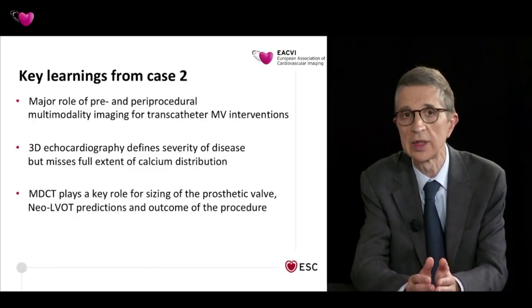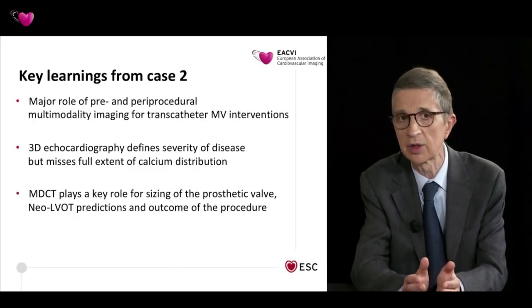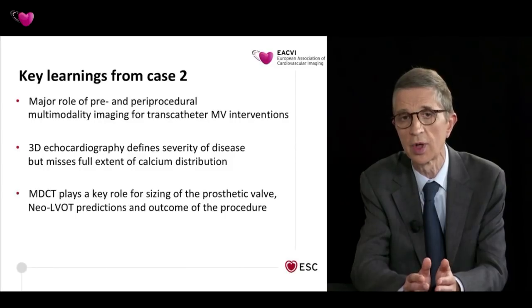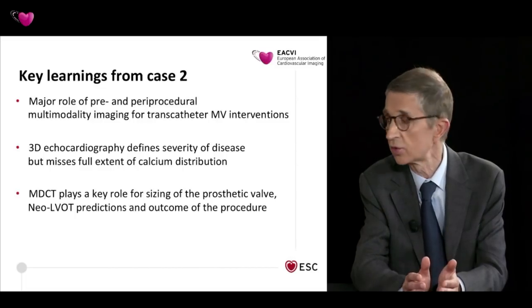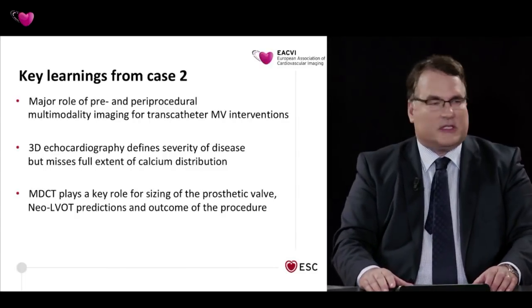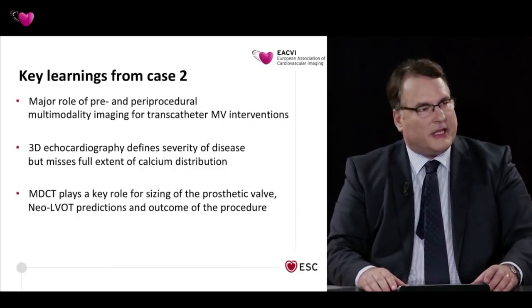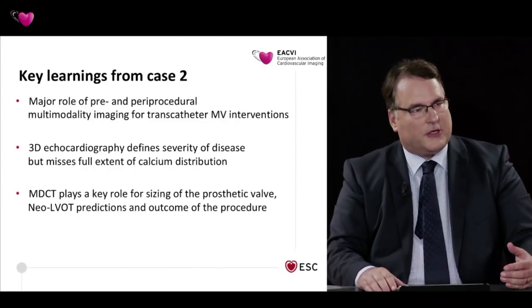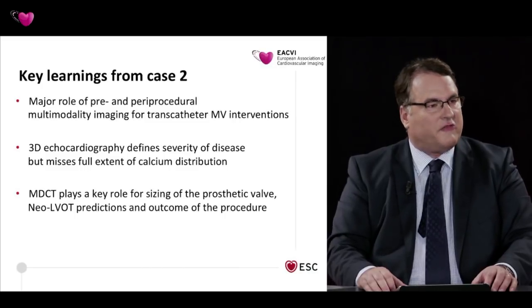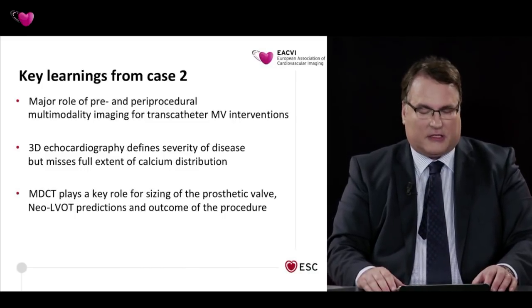We have seen that 3D echocardiography defines the severity of disease, but misses the full extent of calcium distribution in this case. And MDCT plays a key role in this sort of case for sizing the prosthetic valve, neo-LVOT prediction, and outcomes of procedure. So we entered already the multimodality topic, so we're not using two-dimensional echo alone, we're using three-dimensional echo, and with your second case you have added multi-slice CT in a multi-phase analysis. I think this was very nice.